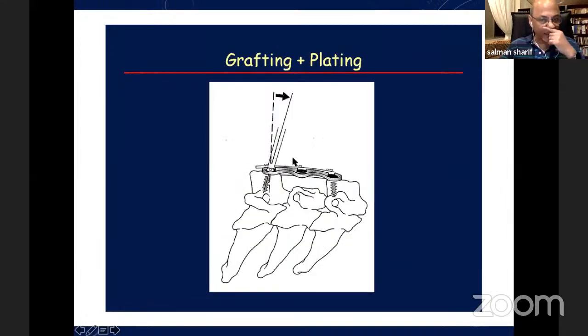This is very important. The majority of the plates we have are dynamic plates, and these dynamic plates will sag. So you don't want to be putting in a straight screw. If at all possible, your plate has to be as short as possible to the edge. It should not be coming onto the other side, because if there's an osteophyte here and your plate, once it sags, goes into the osteophyte, then you will have adjacent segment disease. And that's not because of the patient's problem. It was because of the way you did surgery.